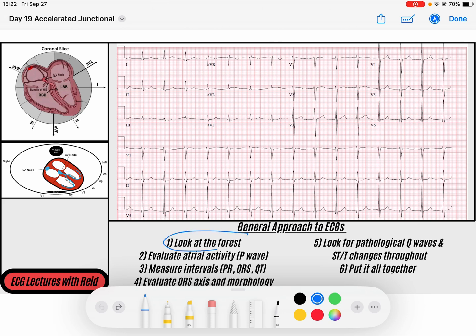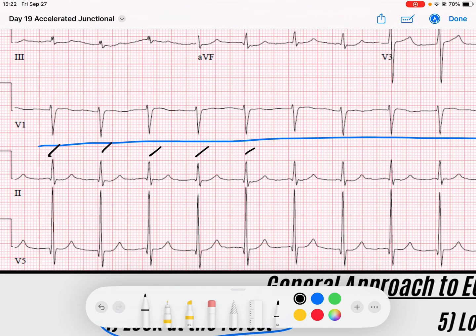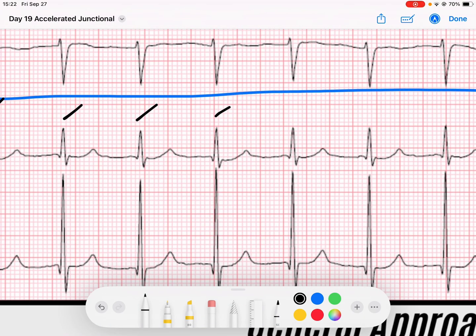First thing we're going to do, like I always do, is get an idea of what's going on with the rhythm. When I scan through, I notice that we have a regular rhythm. If you look here, we've got QRSs that are rattling off as expected. If I look closely to develop a better idea of ventricular depolarization, I notice that I have a narrow QRS.